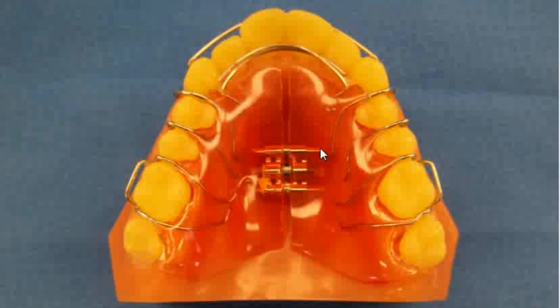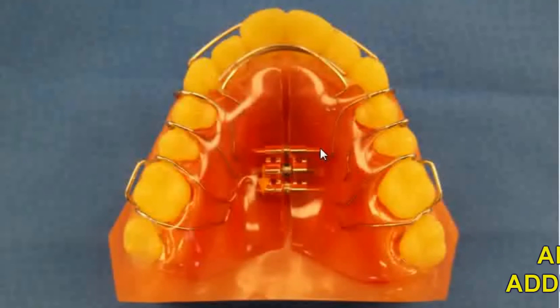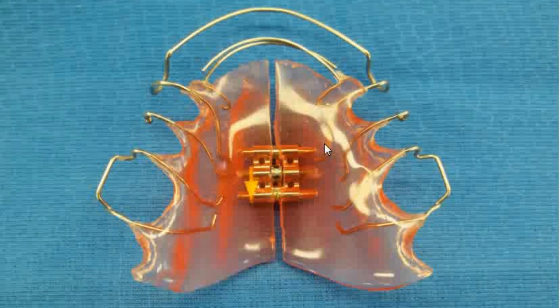Removable expanders provide more flexibility than fixed expanders. You can add all types of auxiliaries to these appliances so you can do more than just expanding. The idea is to try and get as much out of these appliances as possible while they are wearing them, so there is less to do during the next phase of treatment. Let's take a look at some of the auxiliaries you can add to these appliances and what you can accomplish with them. One of the most popular items to add are finger springs.